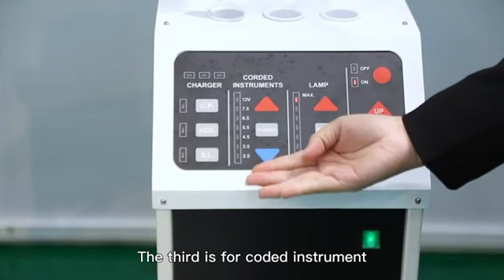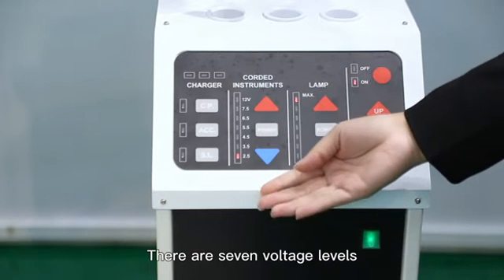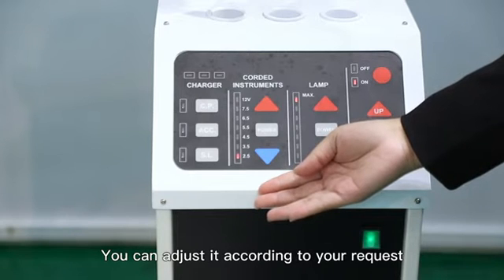The third area is for the corded instrument. Power on — there are seven voltage levels. You can adjust it according to your requirements.